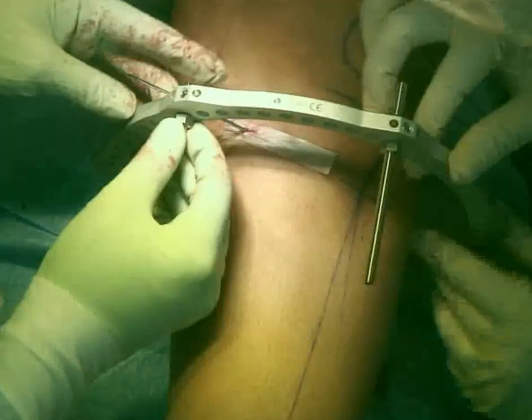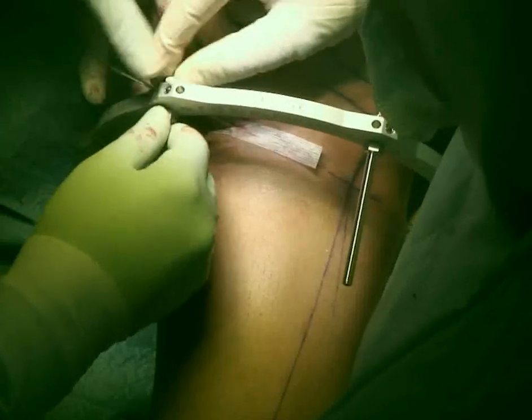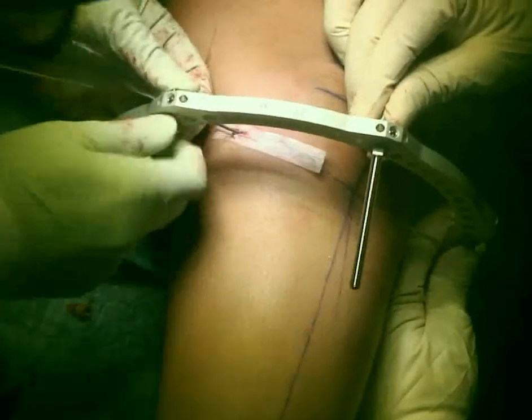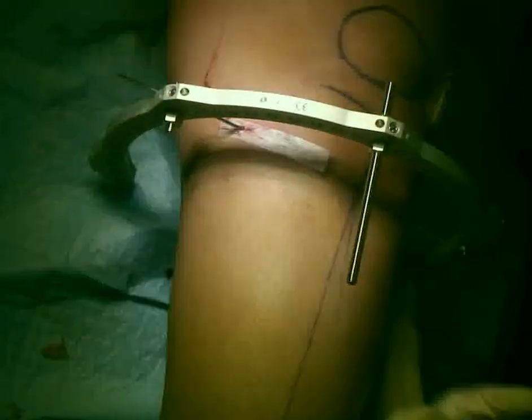Here I put my fine wire parallel to the joint surface, then I fix my proximal ring, which is big enough to allow for the soft tissue swelling and is open from behind to allow for the knee bend. Then I'll check the x-ray.